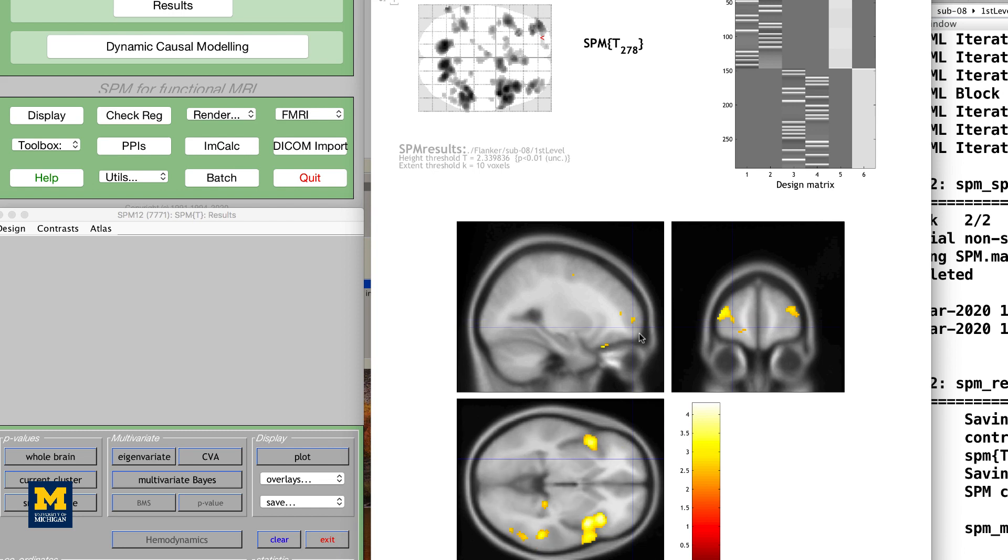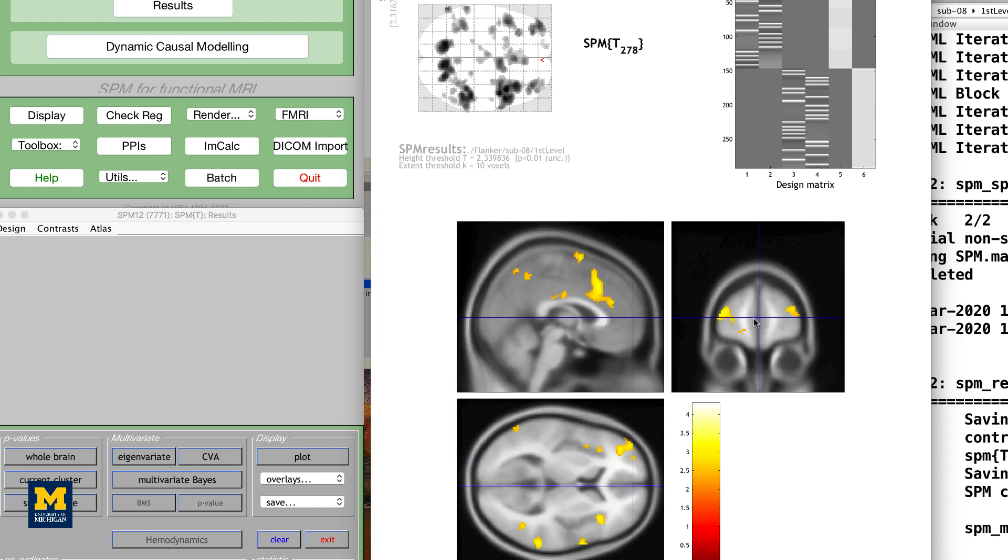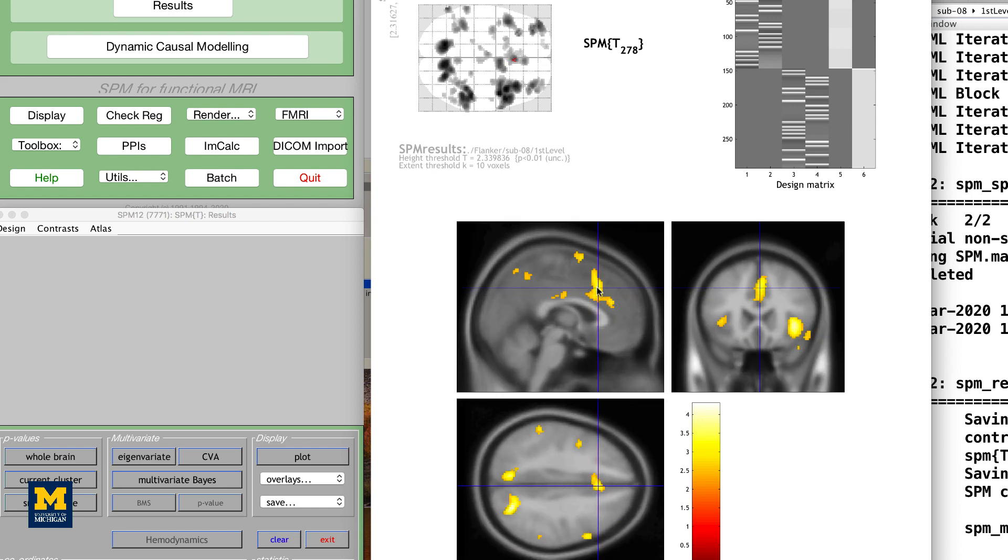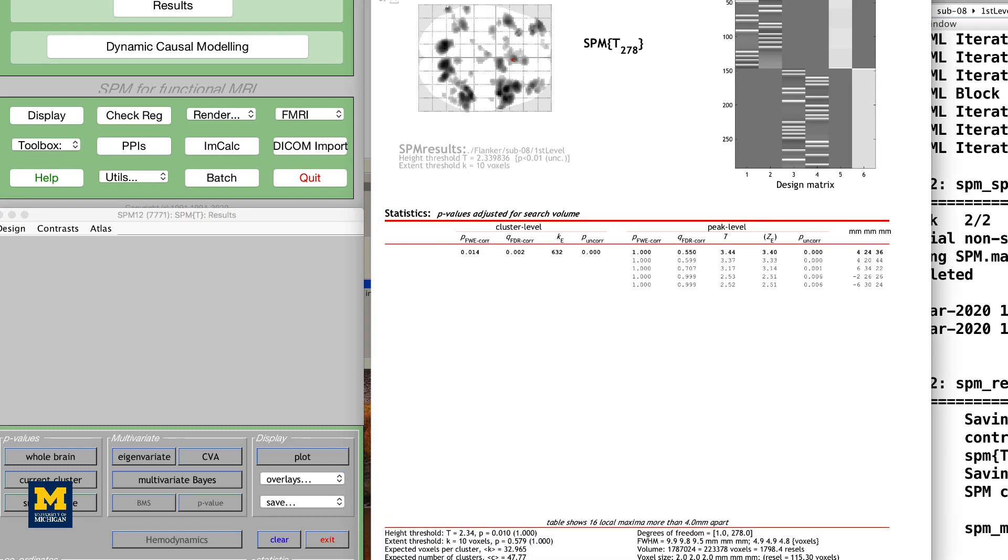If you place the crosshairs over a particular cluster and click the current cluster button in the results window in the bottom left, the statistical table will reappear, highlighting the coordinates of the cluster you have selected.